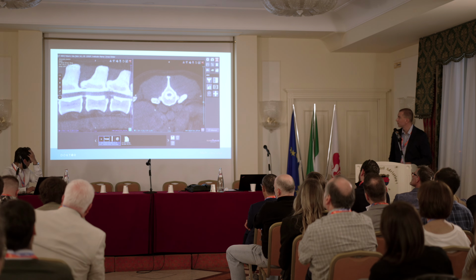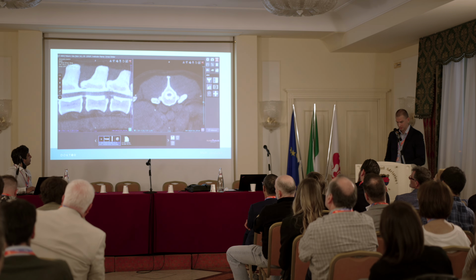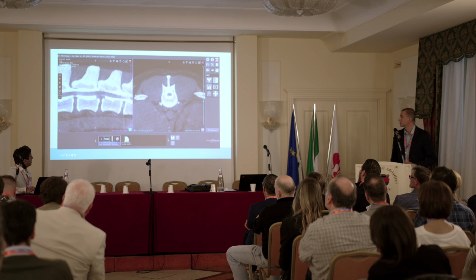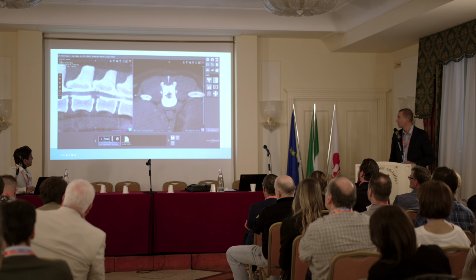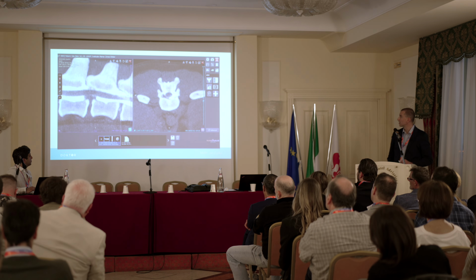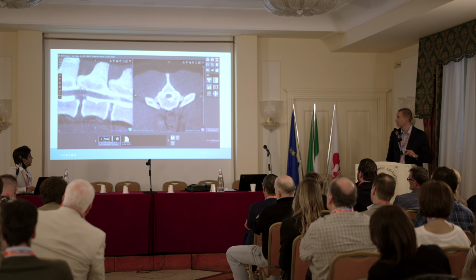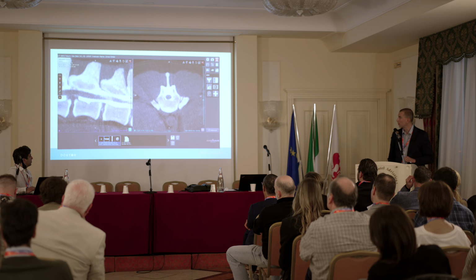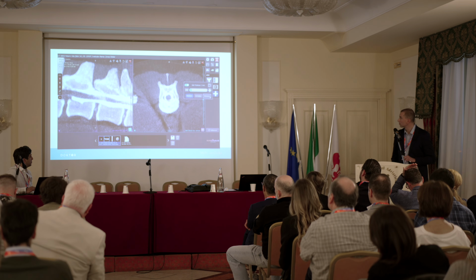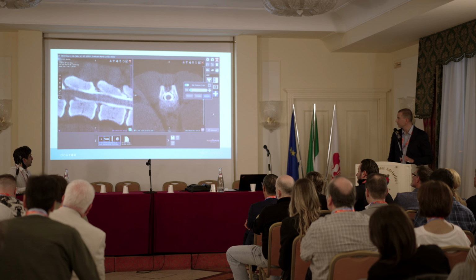And because I love this new version of the software, there is a nice video. How does it work? So you can see the myelo, and on the right side there is a right-sided compression, and you can see it was more cranial, and when we moved a little bit more caudal, there was narrowing of the disc extrusion.